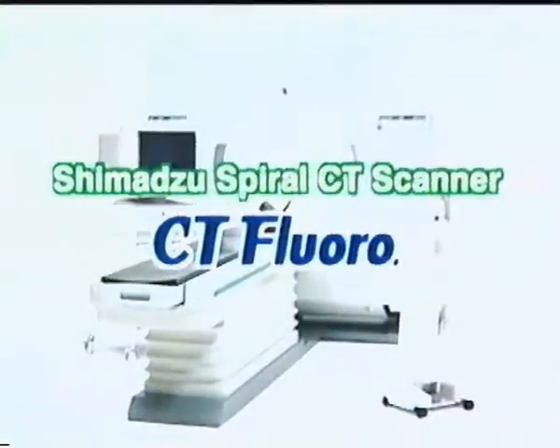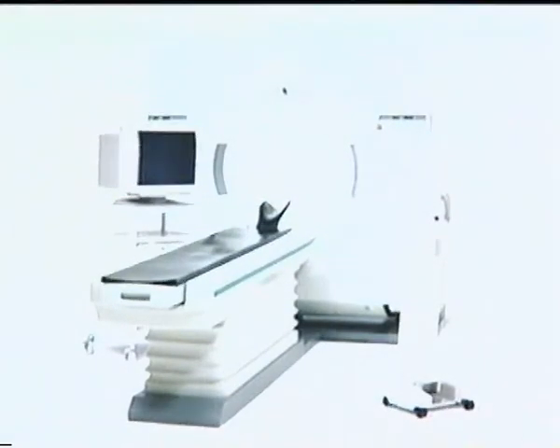Now let's look at a second application. CT fluoroscopy can be used to confirm the location of the leading tip of the puncture needle in real time, enabling more accurate biopsy and infusion of anti-cancer drugs as the needle is inserted.